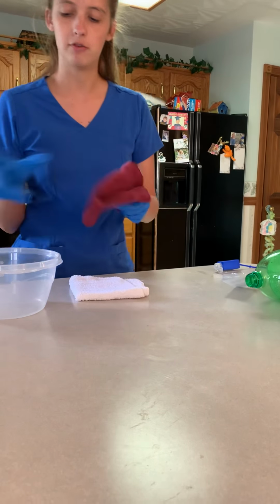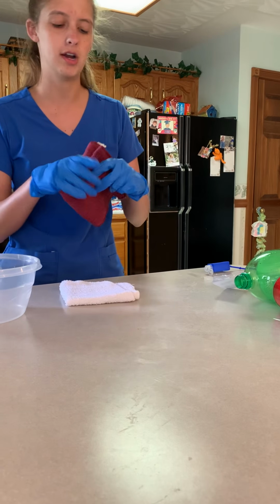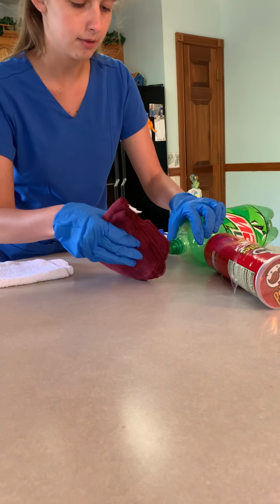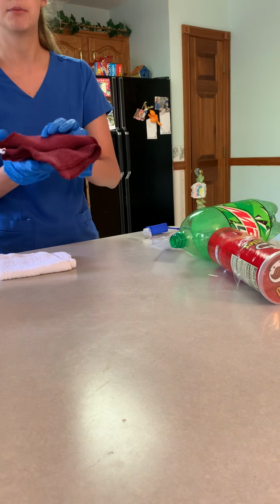All right, and next I would fill my basin up with just warm water this time and rinse out the soap and water the first time. So we just have warm water in our basin now, so first we're going to rinse off the head of the penis, going in a circular motion around the head of the penis, using a different part of the rag.